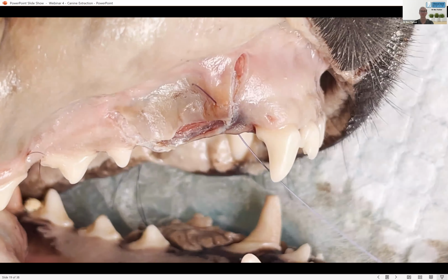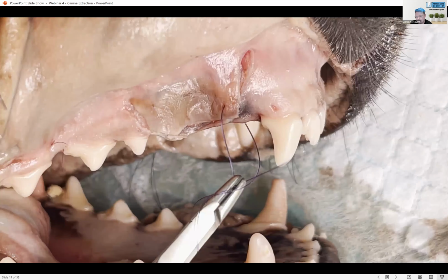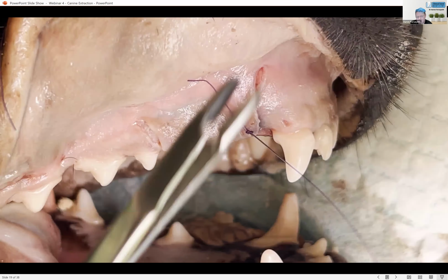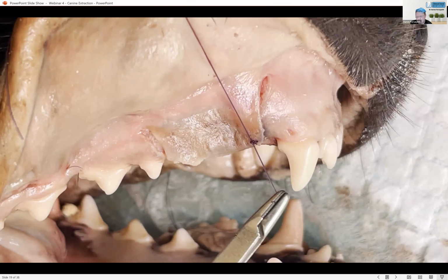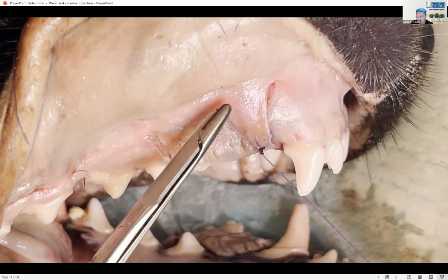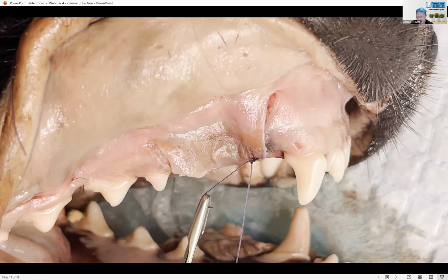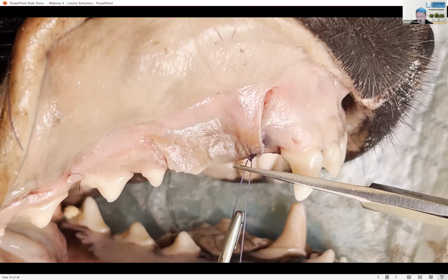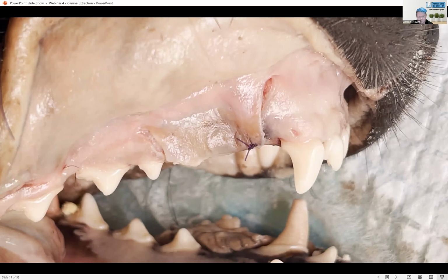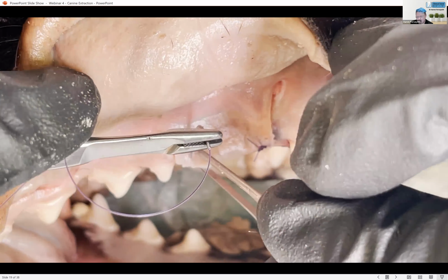So this is actually just 4.0 monosyn right at the moment. And Beck and I both do similar. We both place our corners first, so just general placement of the flap where we want it to sit. We pop a corner in. Again, nice sharp scissors here. They're going to come in, and just using the tip, we don't have to get it seated way back. Boom, gone. No mucking around, not using two arms to close it on there. It's snipped. We can move on.